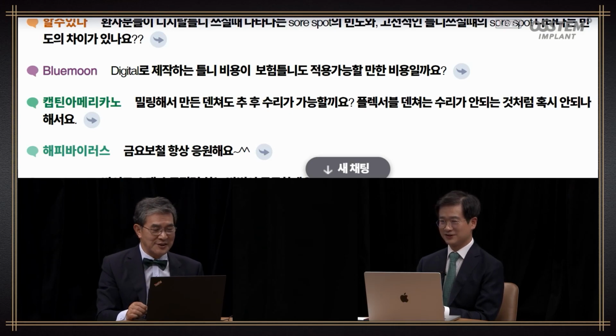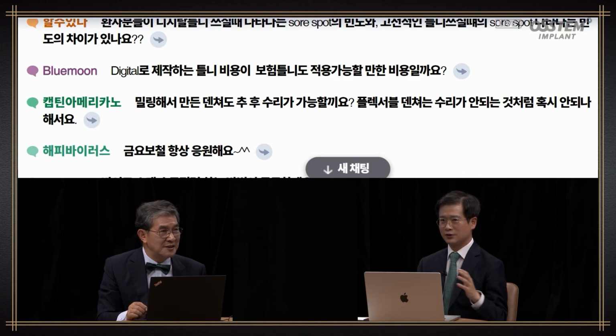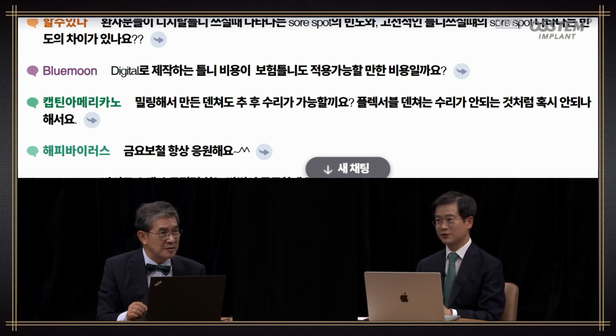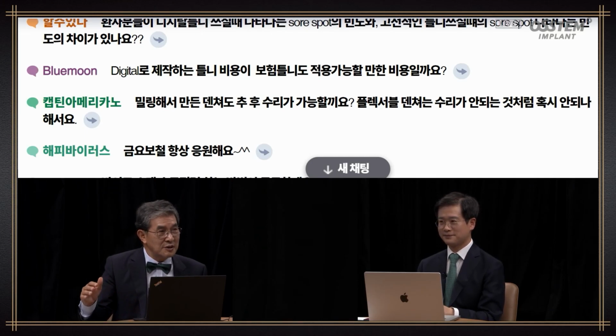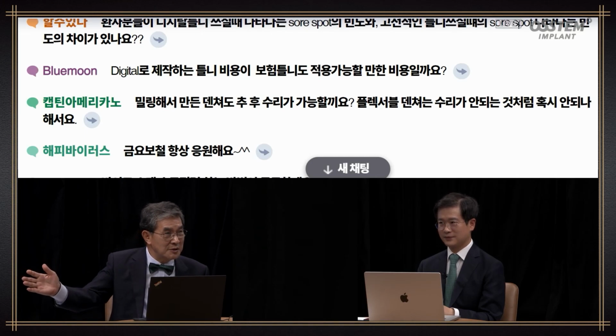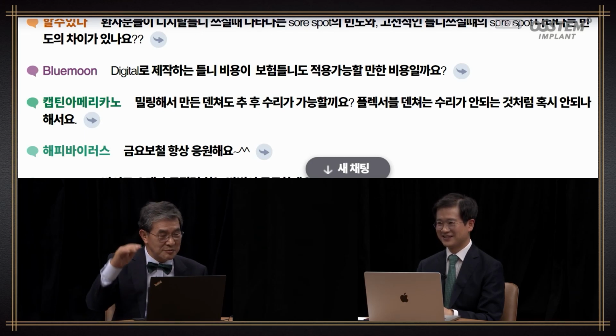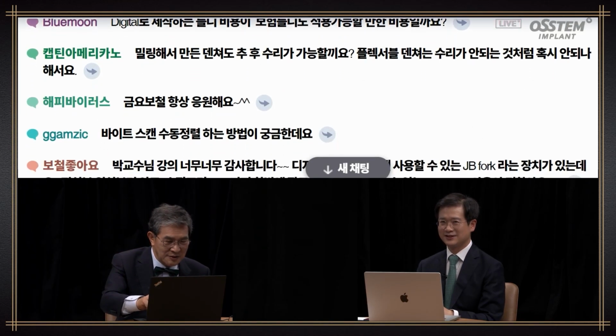Well, that depends on the lab operation. There are still more steps needed currently. But if you don't want to use pack and press and really switch to all digital, then with the digital investment, it will take time, but cost might go down. So if you do it yourself, it will not be as high in cost. But if you use labs for this, then there will be associated cost.